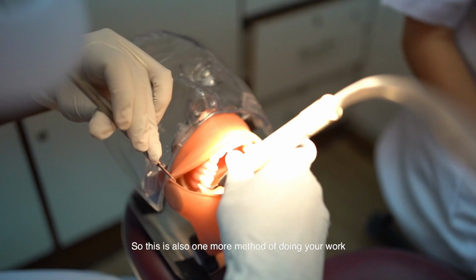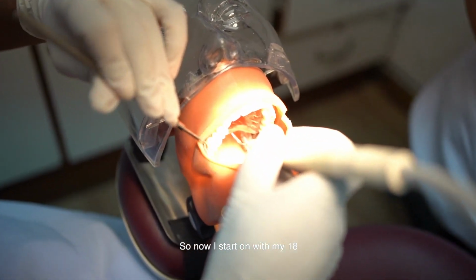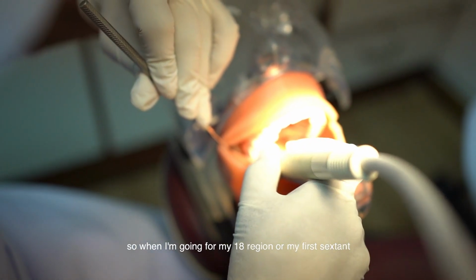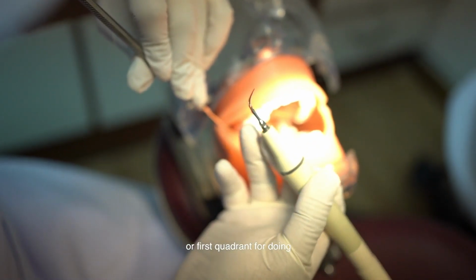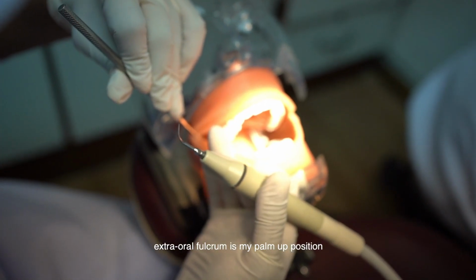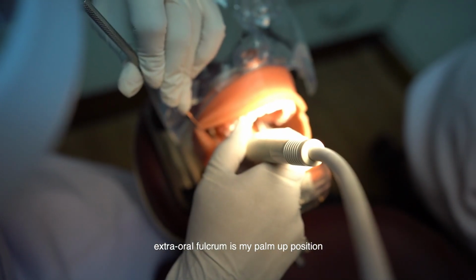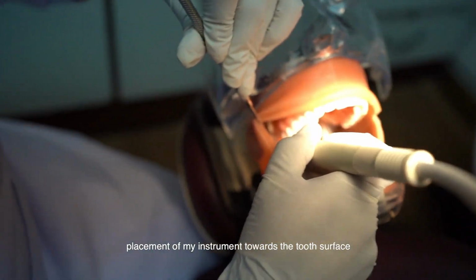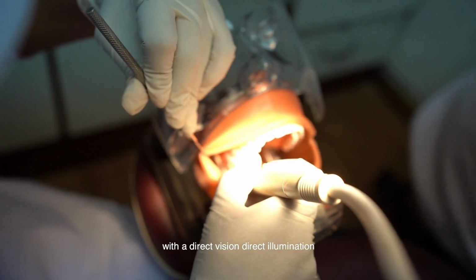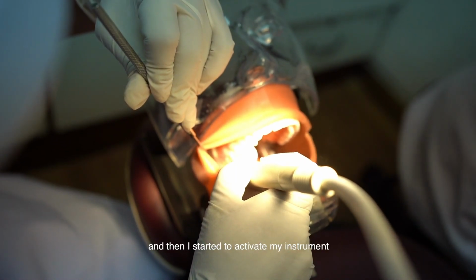So now I'll start with my 1/8. When I'm going for my 1/8 region, or my first sextant or first quadrant, I go in for the maxillary region, with the extraoral fulcrum in my palm up position, placing my instrument toward the tooth surface with direct vision and direct illumination, and then I start to activate my instrument.